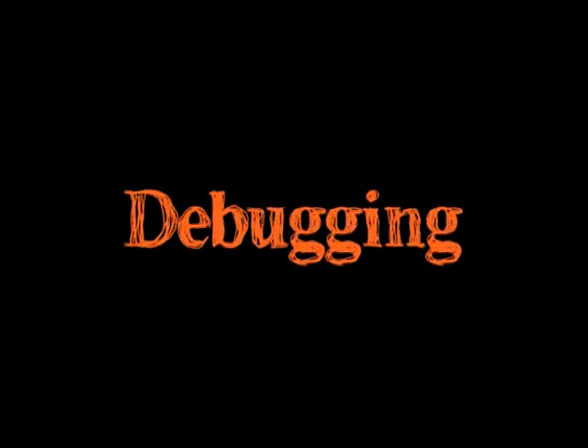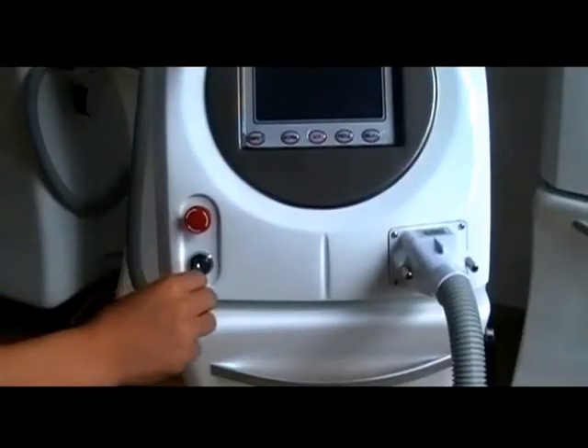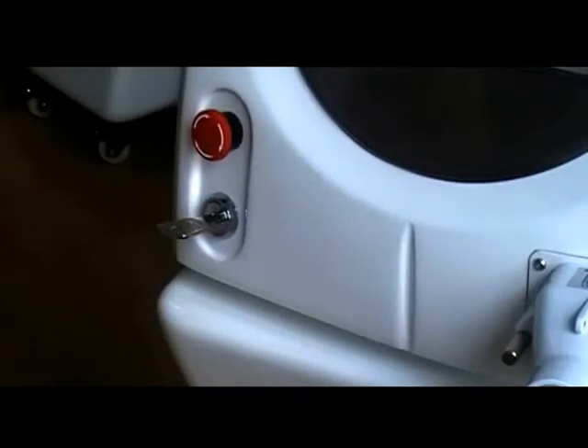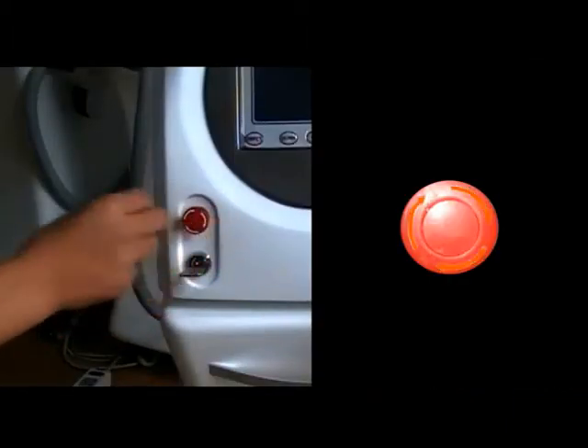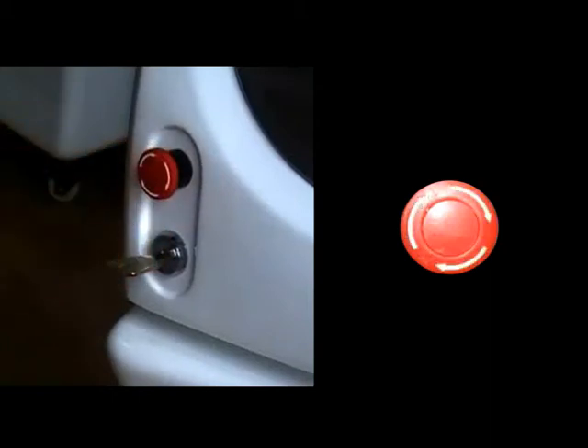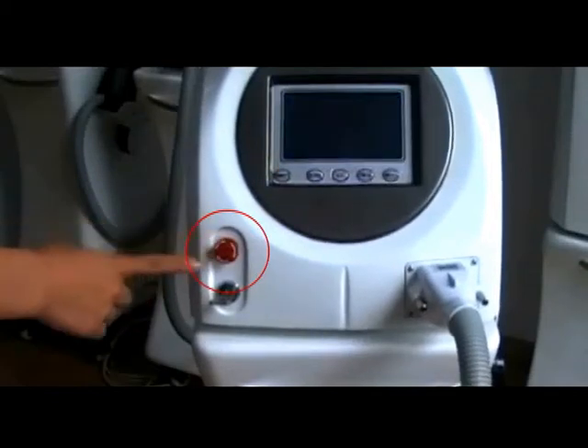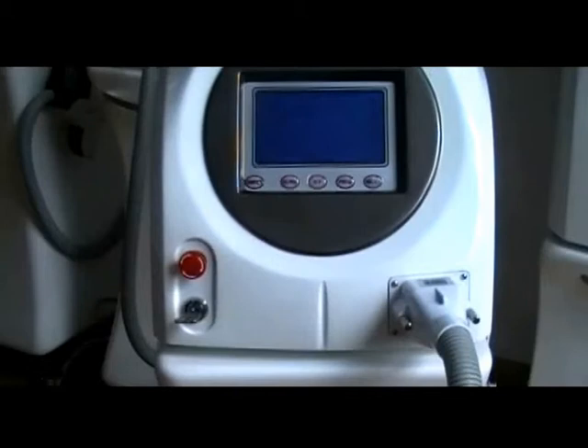Debugging: turn the key in the clockwise direction to launch the machine. If the machine fails to launch, rotate the emergency switch clockwise and keep it in the released position. Pressing this switch will cut off electricity supply and stop the machine immediately. Keep warming up the machine for one to two minutes.